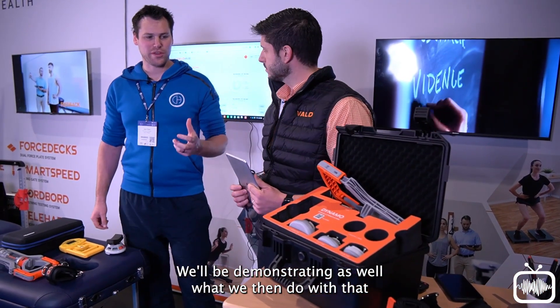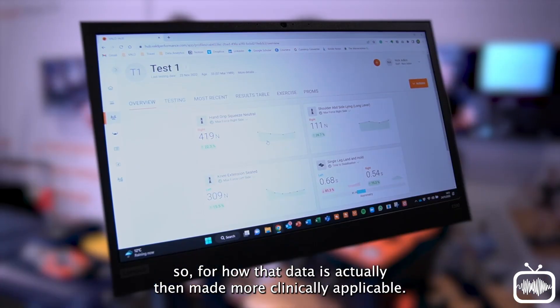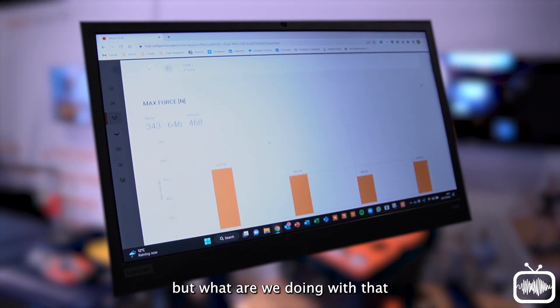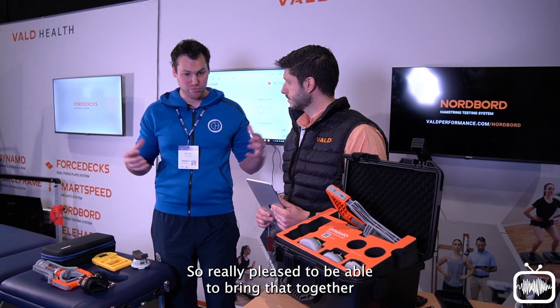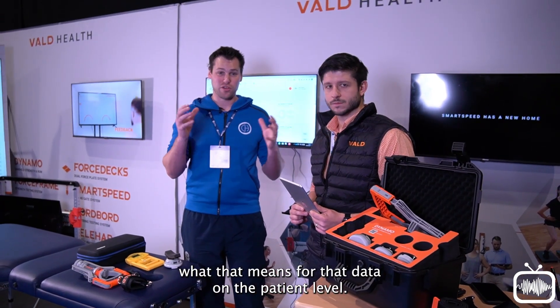We'll also be demonstrating what we do with that data and how it speaks to VALD's hub — rightly famous now for how data is made more clinically applicable. These things are often just given as a reading in Newtons, and you're having to use your note system to document that against the same patient. So we're really pleased to bring that together and demonstrate what it means at the patient level.